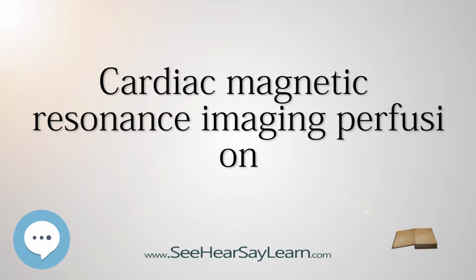In contrast to the nuclear imaging modalities, PET and SPECT, CMR perfusion does not involve the use of ionizing radiation and can therefore be used multiple times without the risk to the patient of exposure to radiation. It is a non-invasive test, is generally regarded as a safe procedure, see below, and is well tolerated by patients, apart from people who suffer from claustrophobia.